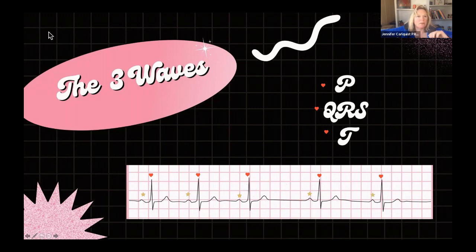And let me ask you guys a question. Type in the chat, what do you think about those P waves? Do they look the same? Do the P waves look the same to you? All right, let's see. We've got no. Okay, good. Oh, hey, Chris. Brogna's here. Krista, Christina, and Robin. Okay, so everybody's pretty much agreeing the P waves don't look the same. I agree with you.